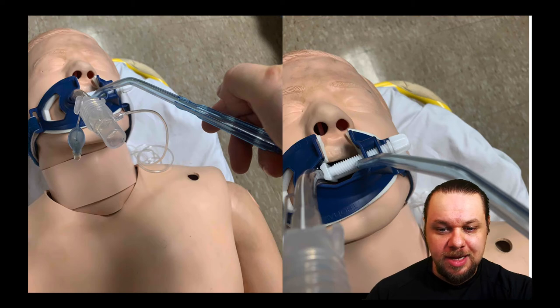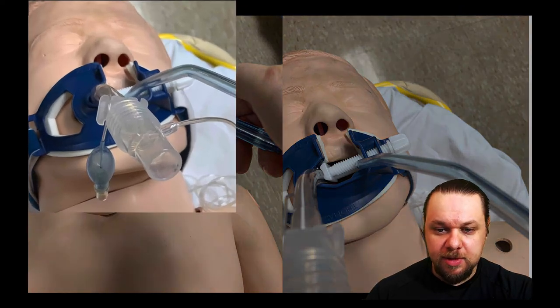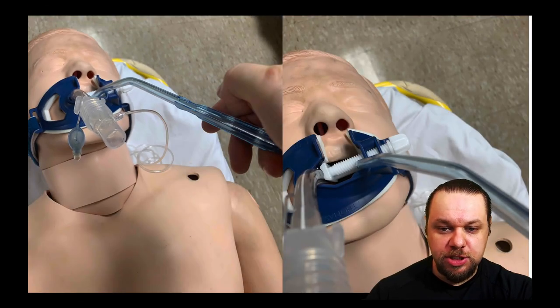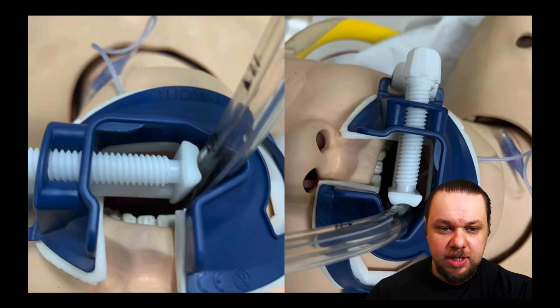If you place it upside down, you can see that the Yankauer cannot enter the mouth — the screw clamp is precluding insertion of the suction device. This is why it's important to place the mouthpiece aperture facing towards the patient's feet, so that you have easy entry with your suction equipment.